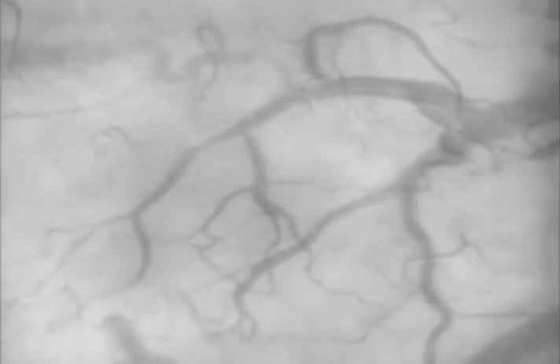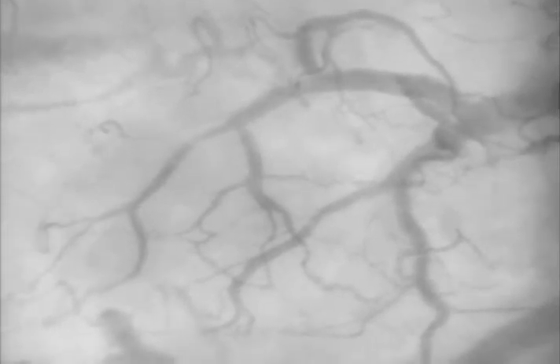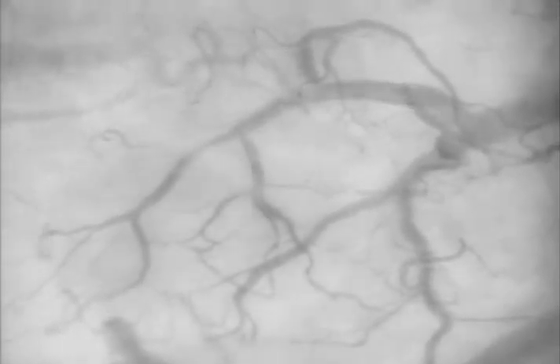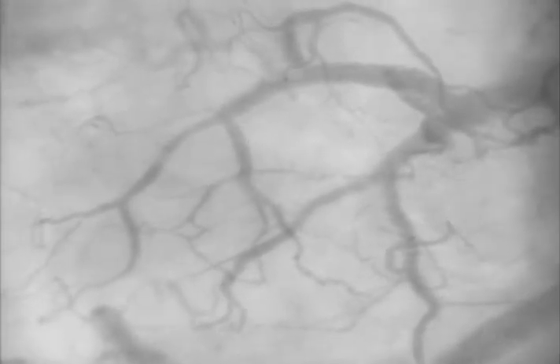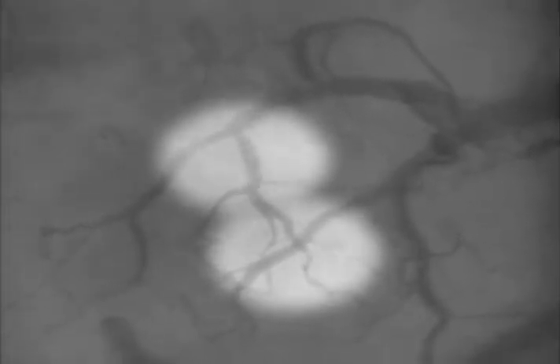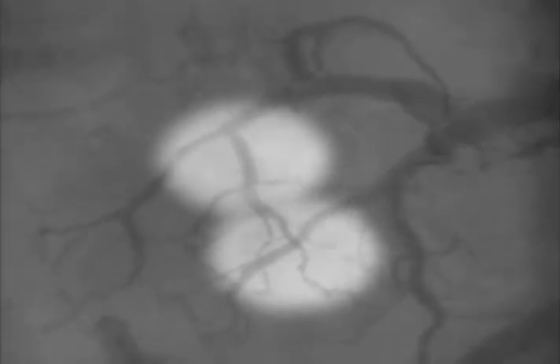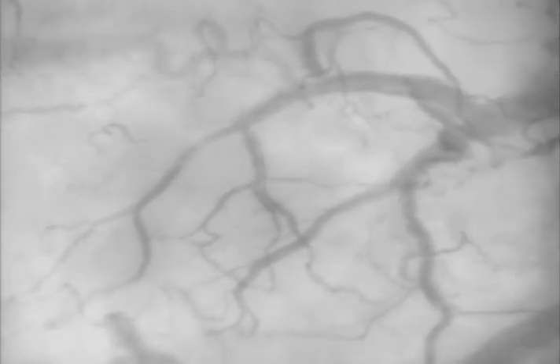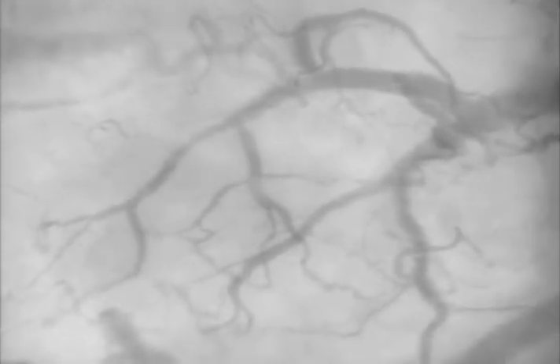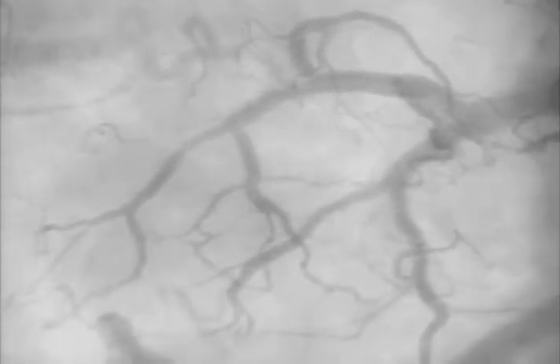Here's our second example. The intermittent sluggish flow in the medium-sized vessels in the middle of the video could possibly be due to pressure. Since we're not sure, we'll score this video a 1. Remember, a score of 1 means that there is suspected pressure. Scoring videos with a 1 does not stop us from analyzing it.